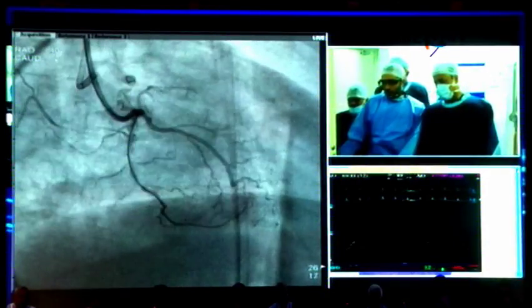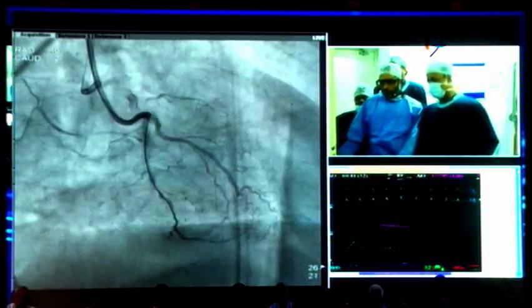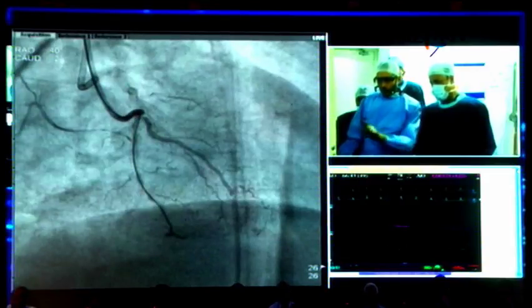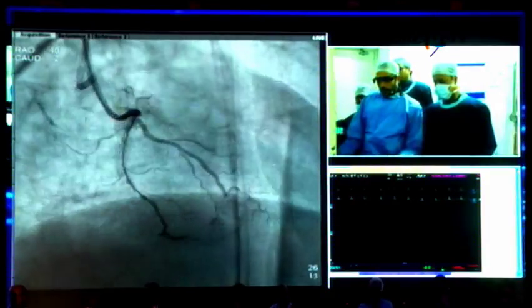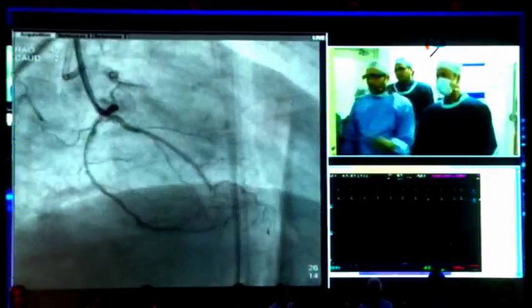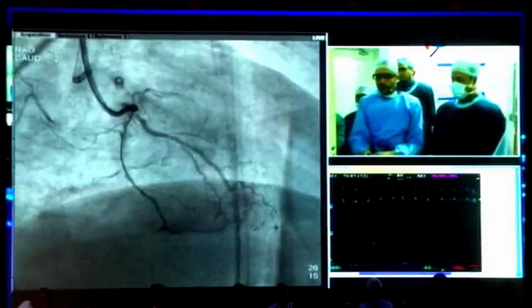Please. Thank you, guys. Okay, good. Next. Keep going. That is very small, thin. Okay, leave it right there. I want that view. Perfect. Put it up there. Reference it. Yeah, but we have 2 hours, not 1 hour. Reference this. Put it up there, on the right side. Literally up. Okay, good.